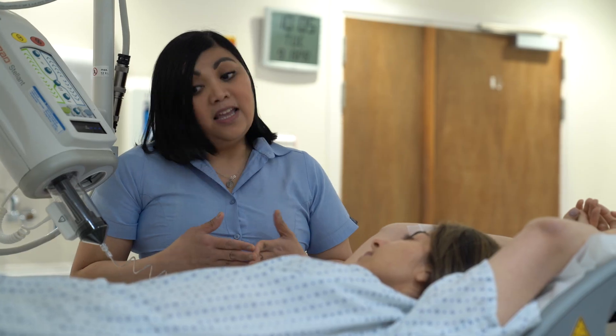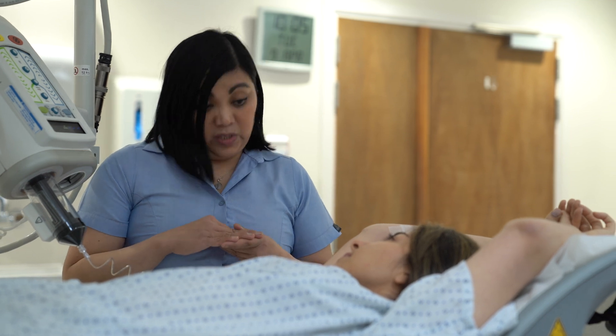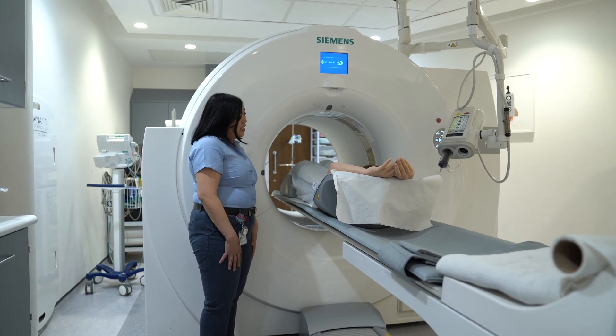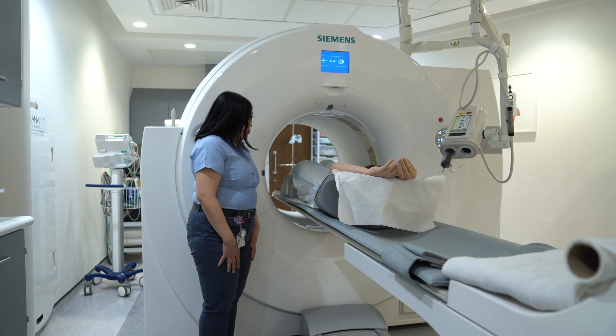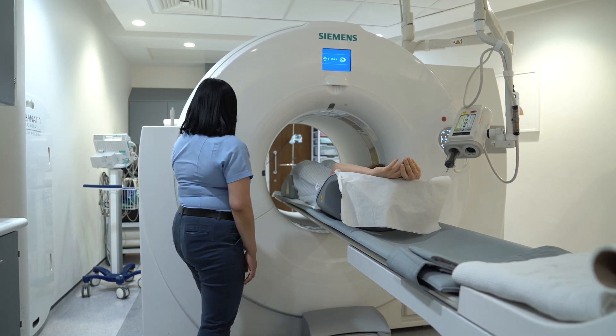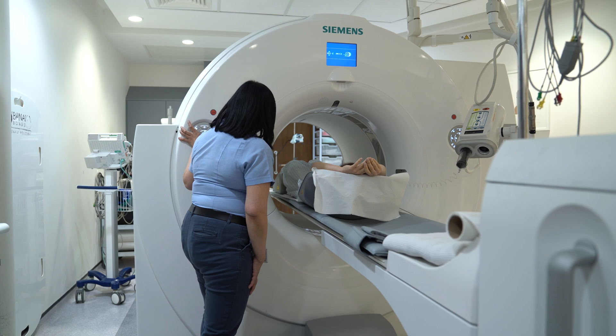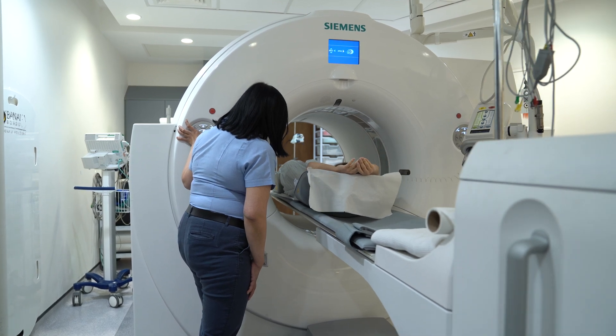For the cardiac FDG PET CT scan, the patient will need to follow a non-carbohydrate diet on the day prior to their scan and fast for 18 hours before their appointment to ensure their heart is not metabolizing carbohydrates. Before the scan, we will give the patient an injection of a radioactive tracer and then ask them to rest for just over an hour while the injection is being absorbed from the bloodstream.